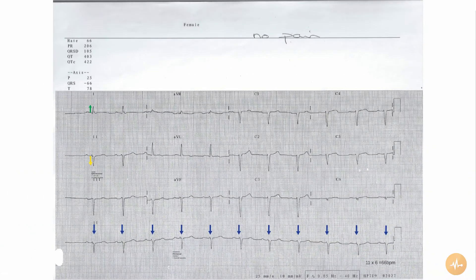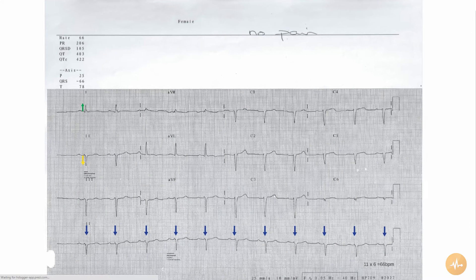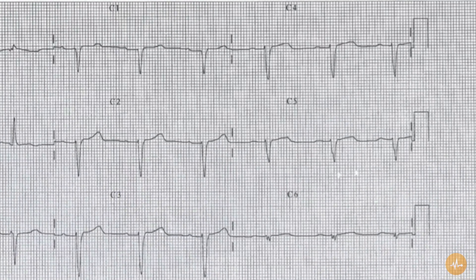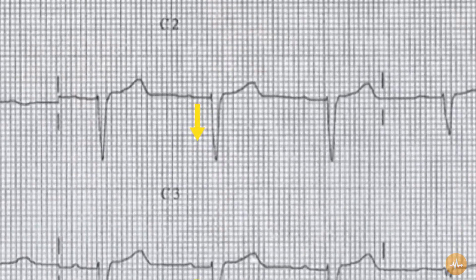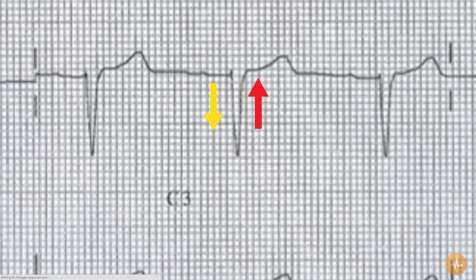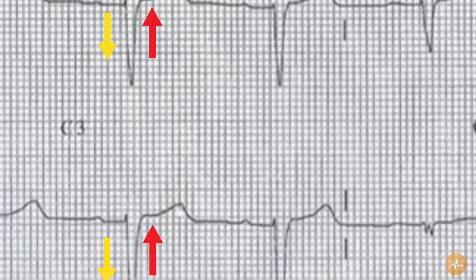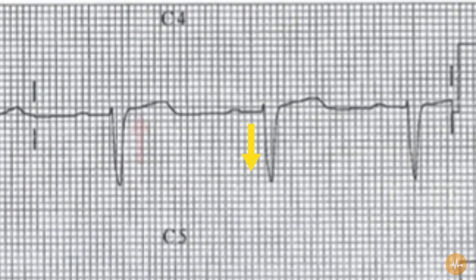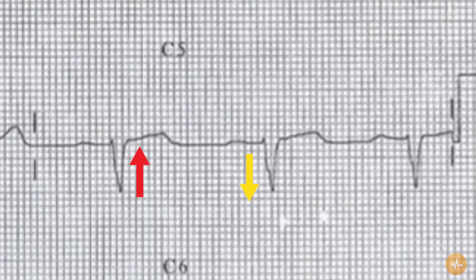There are no pathological Q waves. There is complete absence of R wave progression across the chest leads — the S wave remains dominant over the R wave as far round as V6. There is slight ST segment elevation in leads V2, V3, V4, and V5.